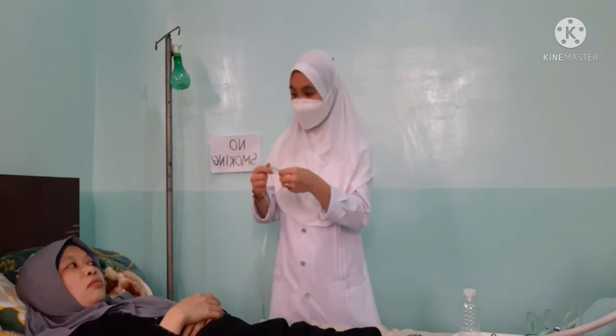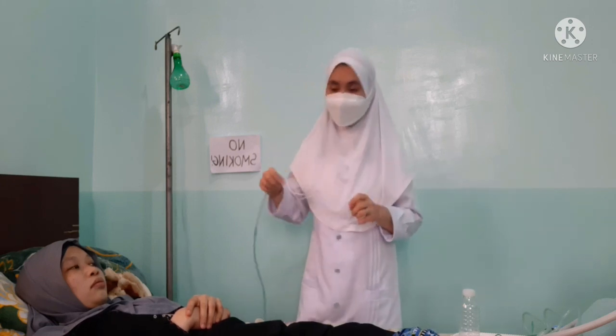Now for the nasal cannula, feel and determine if oxygen is flowing through the tips of the cannula. The nurse should feel the oxygen at the outlets of the cannula, mask, or the tent. Now place the tips of the cannula in the patient's nose with the prongs fitting into the nares. The outlet prongs are fitted into the nares and the tubing is hooked around the ears.